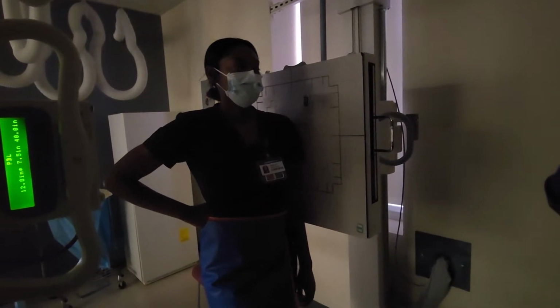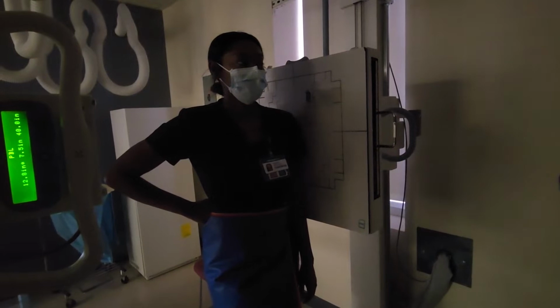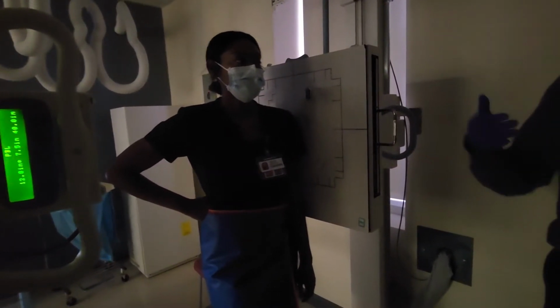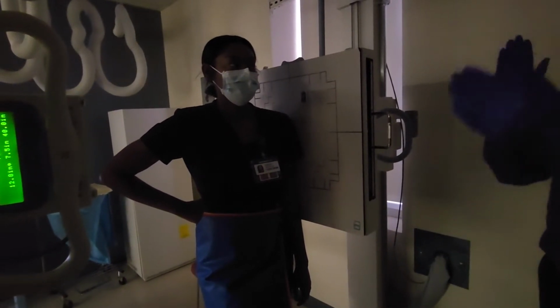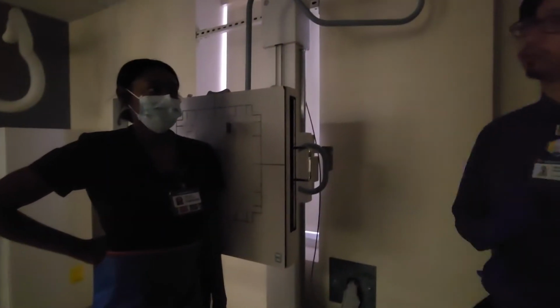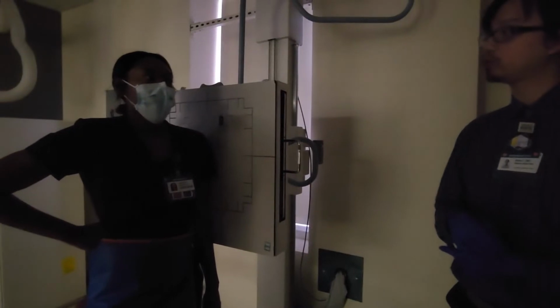seconds long. Normally your x-rays go beep, right? Super fast, half a second or less. But this time when we do our x-ray, it's going to last a while. And the idea here is we are going to make use of this time and have the patient create motion.